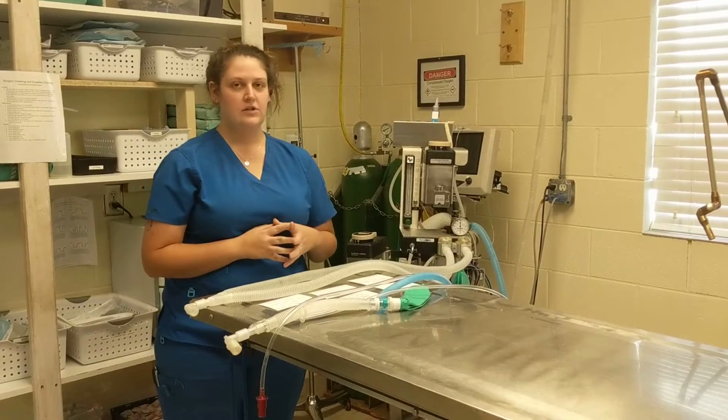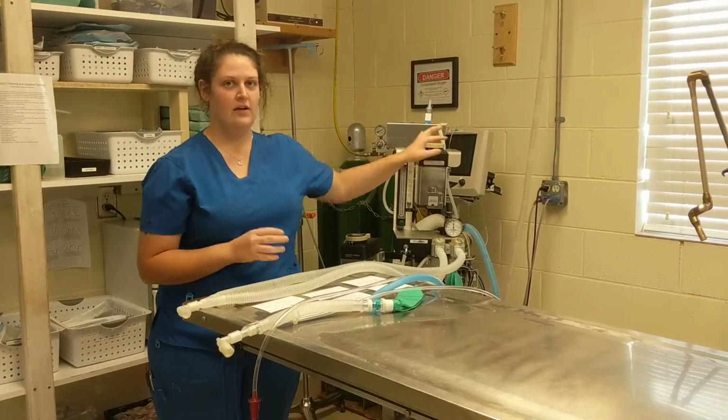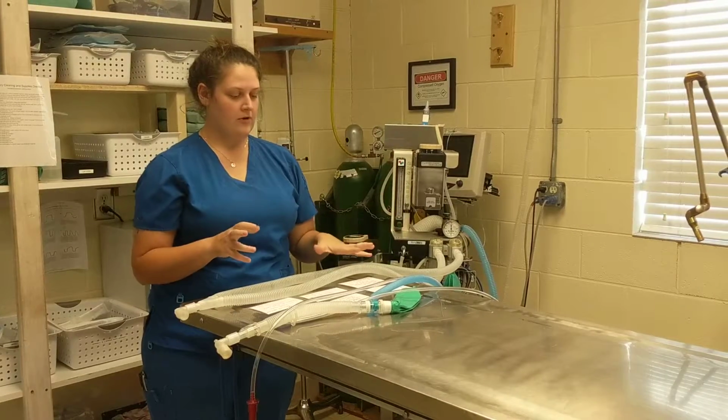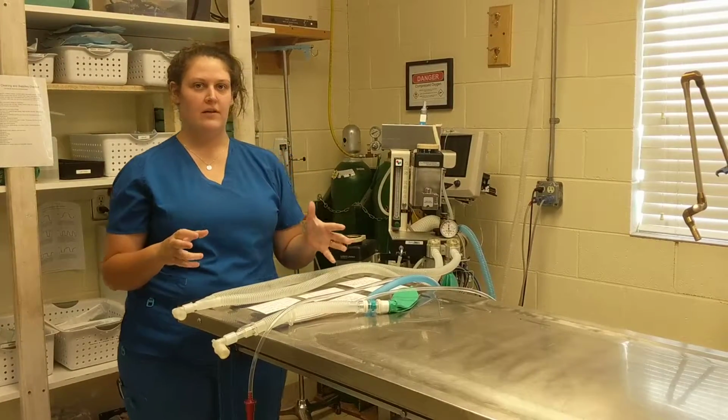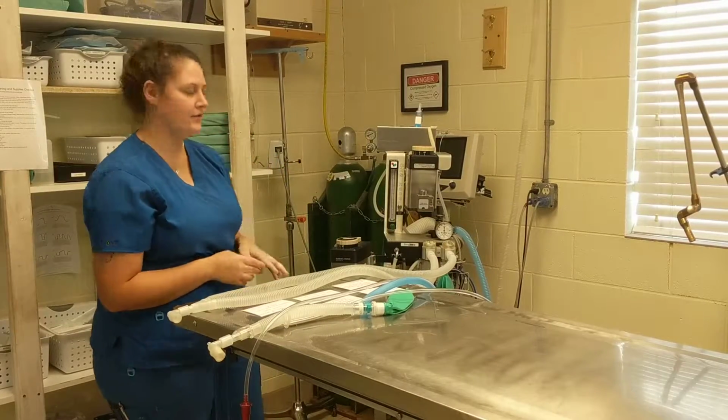An anesthesia machine controls three factors: oxygen, maintenance drug, and the patient. People can underestimate the importance of each component, and that's why I feel it's important to go over these parts. So first we have oxygen.